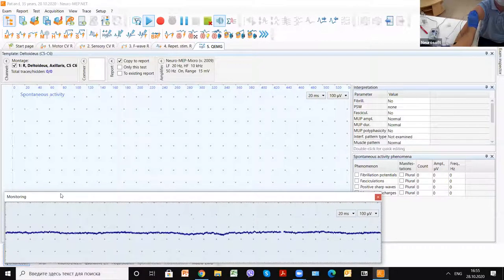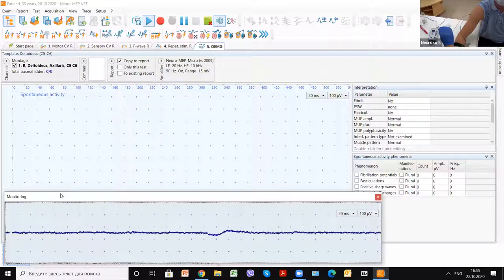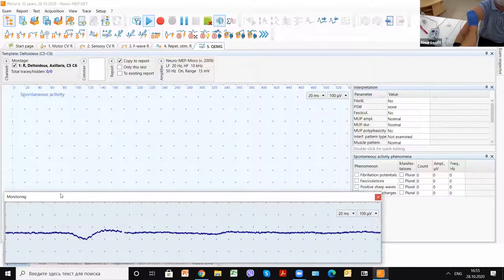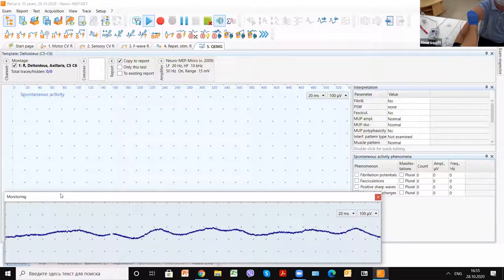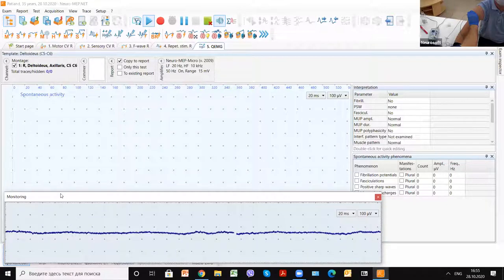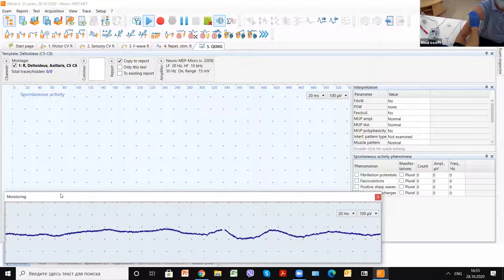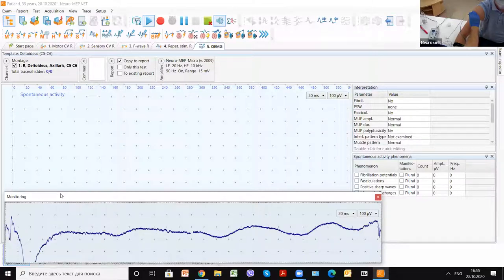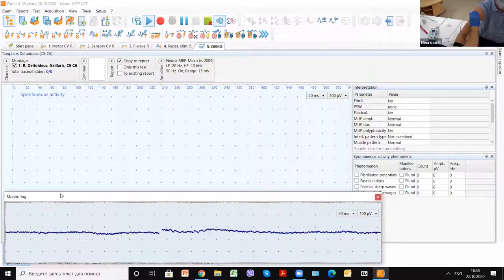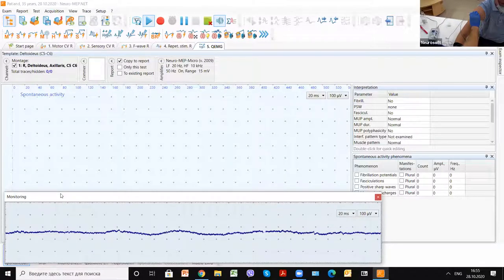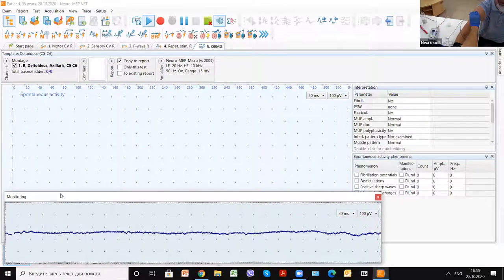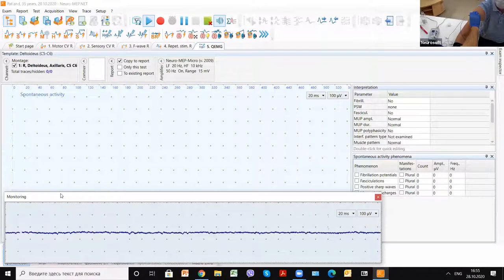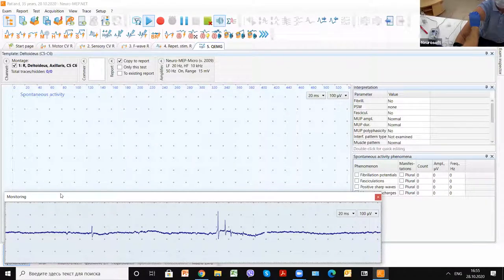At first, we analyze several positions. First is spontaneous activity and insertion activity. Insertional activity we register when we move the needle in the muscle. You can see it must not be very long because that may be pathological. You see insertion activity when I move the tip of the needle in the muscle.